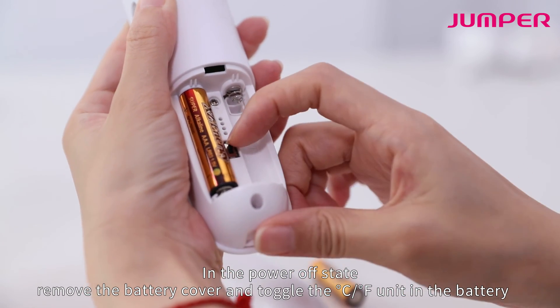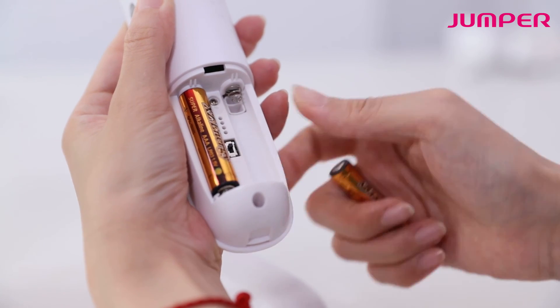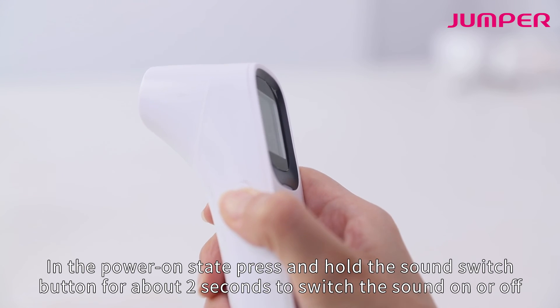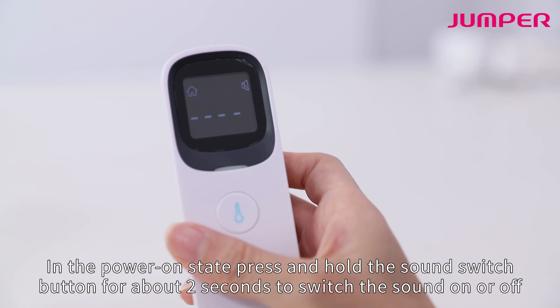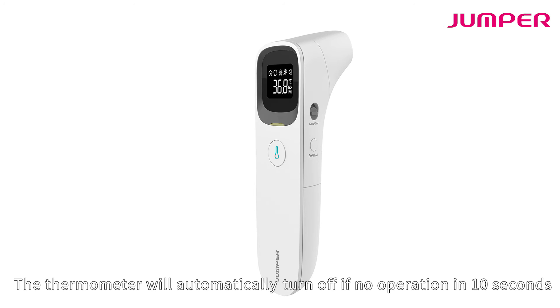For C/F unit conversion, in the power-off state, remove the battery cover and toggle the C/F unit switch in the battery compartment. To switch sound on or off, in the power-on state, press and hold the sound switch button for about two seconds. The thermometer will automatically turn off after 10 seconds of no operation.